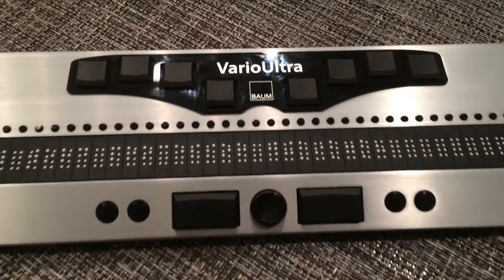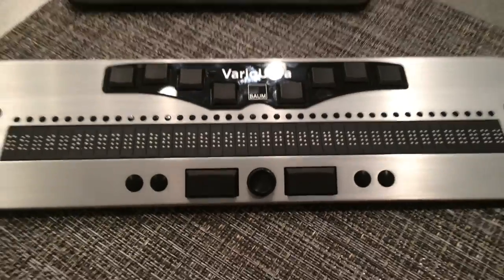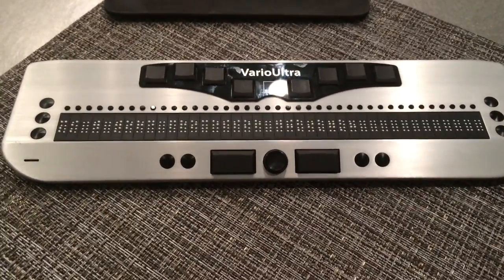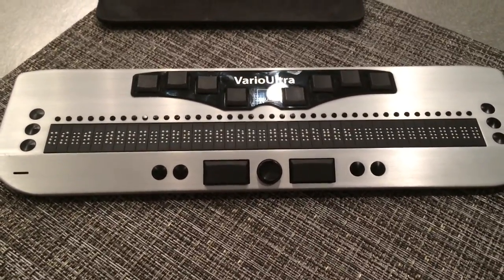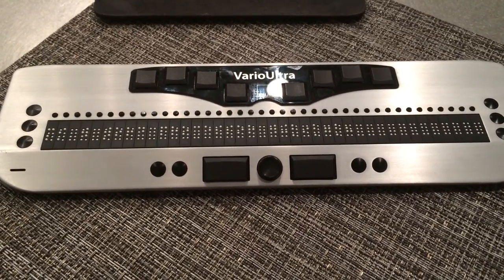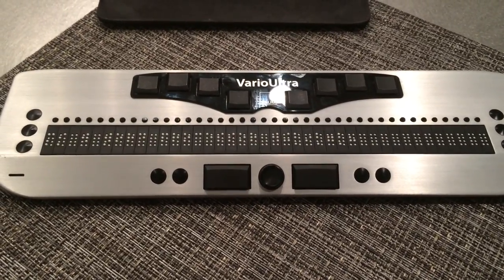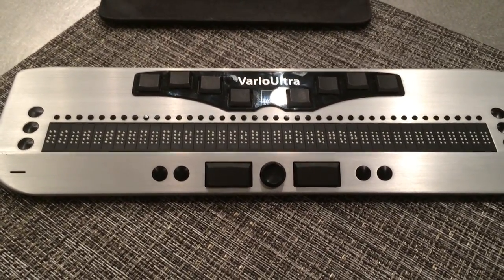Hello, this is David Bradburn, and this is a presentation of VarioUltra, the 40-cell version. It is identical to the 20-cell version in areas of functionality and features. That means it operates as a Braille display or a Braille note-taker. It means that it can connect with up to five devices and allow you to switch easily between them.